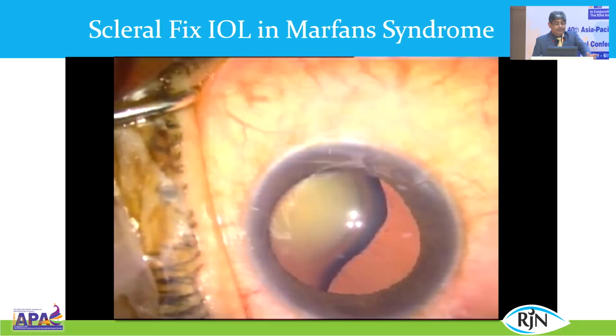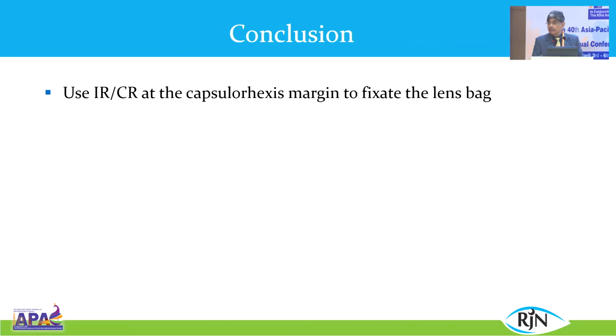This is managed by a scleral fixated IOL, and you can adopt any technique, whichever is convenient, Yamane technique or iris fixated lens.